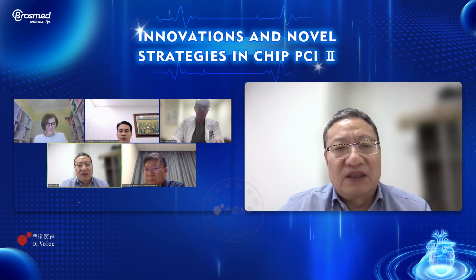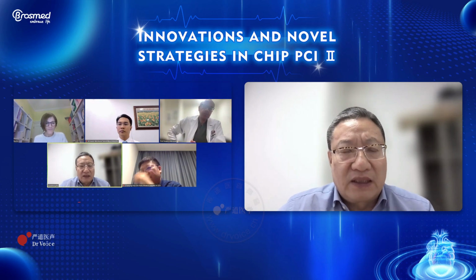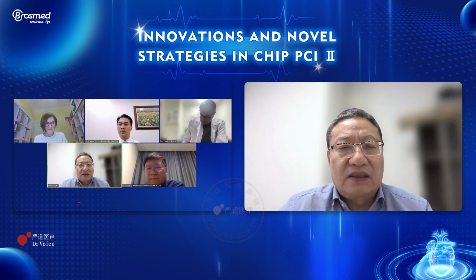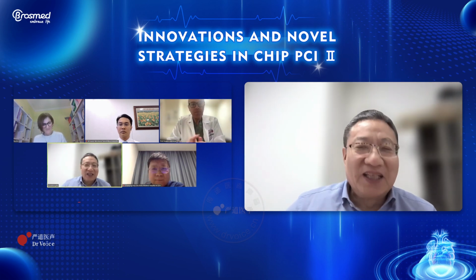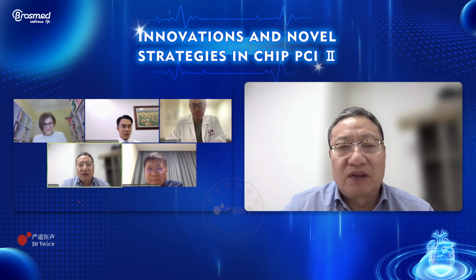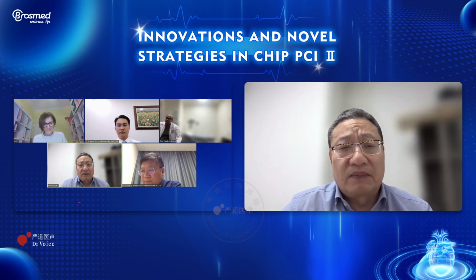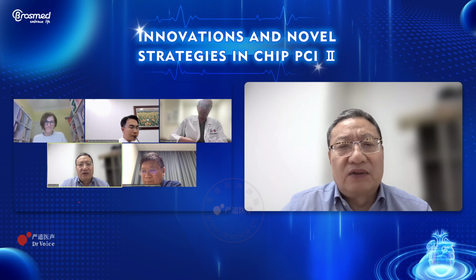Depends on this kind of lesion. So it's usually very tough and a really hard disease, really highly fibrotic stenosis. So I think in these cases, Dr. Routledge did a really good job. I think he used a very special cutting balloon to open these ostial lesions. But in my mind, these kinds of lesions usually have a little bit higher restenosis later than the routine de novo lesion.